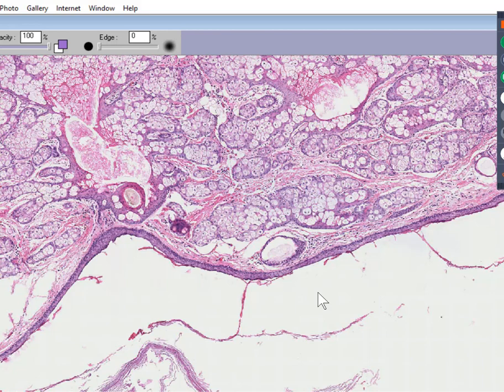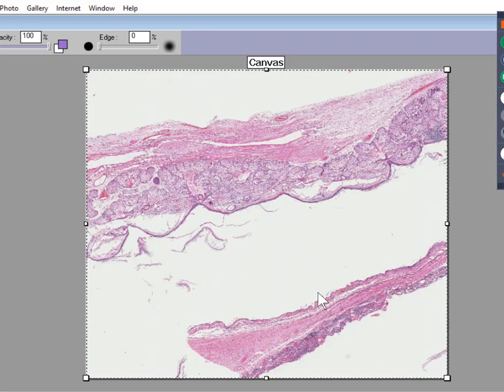In fact, you know it's benign because most of the cells are differentiated into normal, recognizable structures. The old name for this tumor was dermoid cyst, emphasizing the point that it's just a cyst. And when you see the word cyst, sometimes you don't think that's a real neoplasm. But this one is a real tumor. It's a teratoma. It's benign. And a cystic teratoma or dermoid cyst is the most common benign tumor of the ovary of young women.